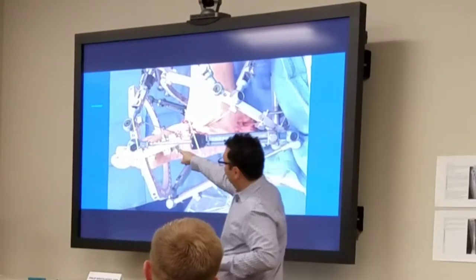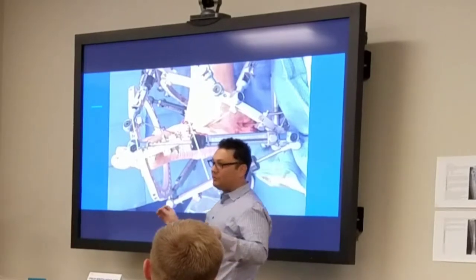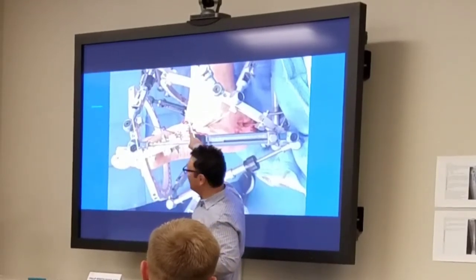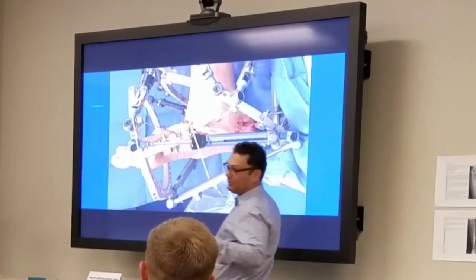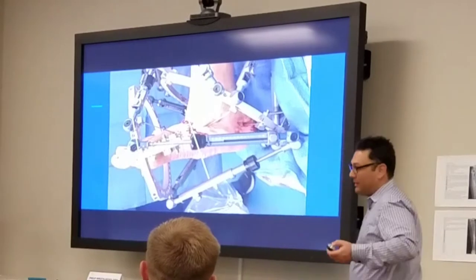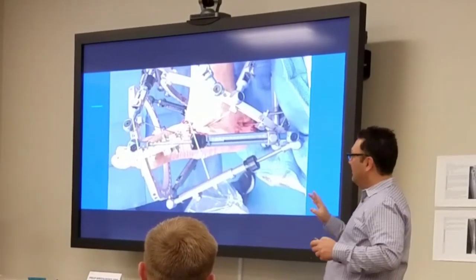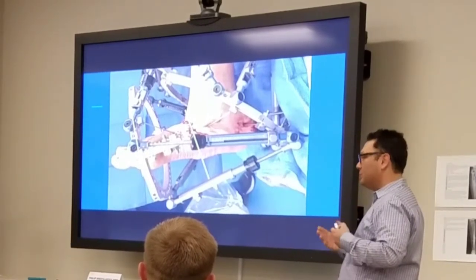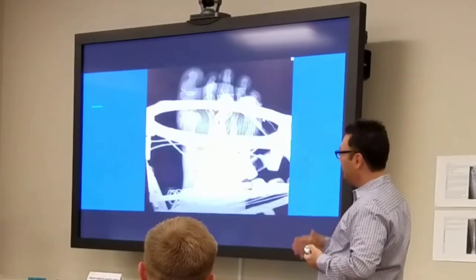Next, distance from the frame to the osteotomy site. Obviously you want to measure it on X-ray for exact measures, but you can do it in the operating room because I know my osteotomy came out right over here. So I can just take a ruler from there to there, and I'll be on by a couple of millimeters. I use the hex, but the hex may be tough on the foot because you can see there's a lot of overlap of things. So until we get that really down pat, get your measurements good.